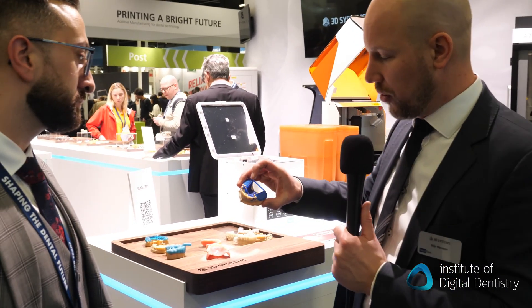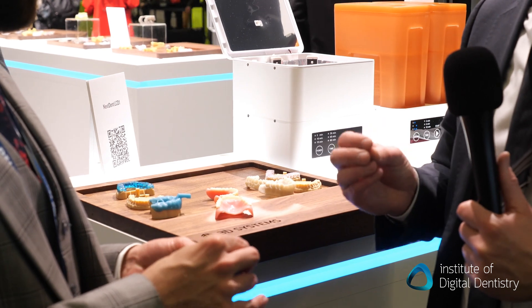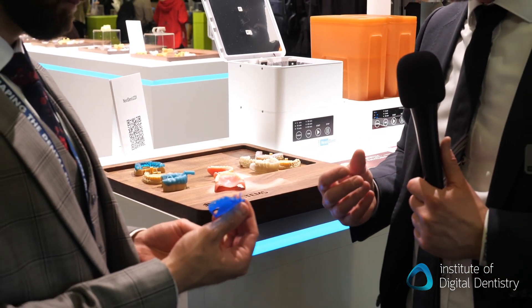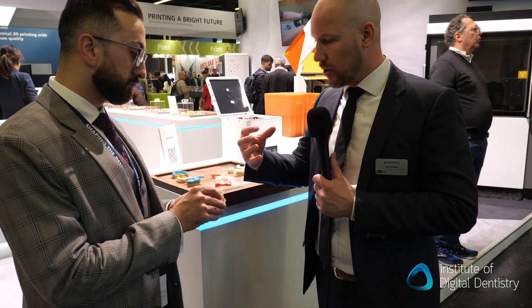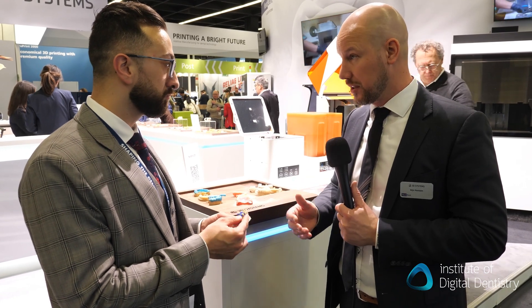We also have a new castable resin called Cast Blue, which is a very interesting material for laboratories, as it is much stronger than the old cast material. You can really put it on and off the model multiple times, and it has very good combustibility — it burns out very easily.